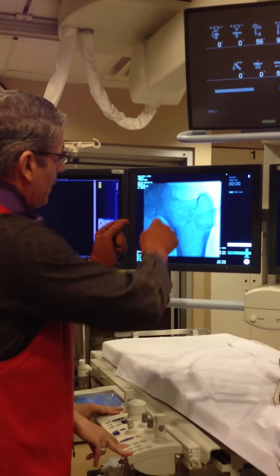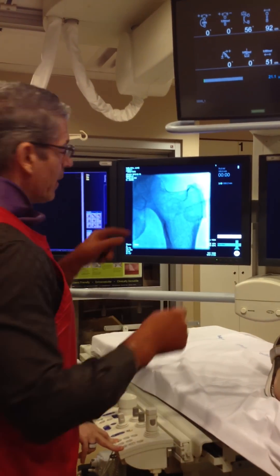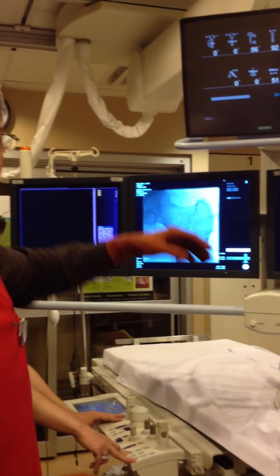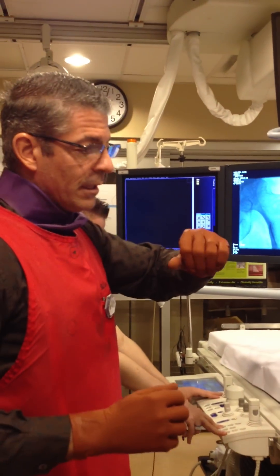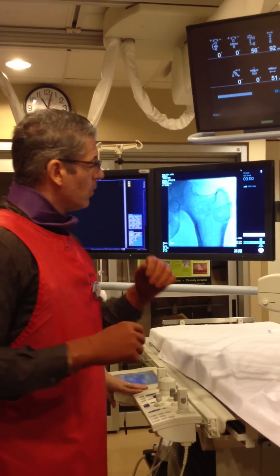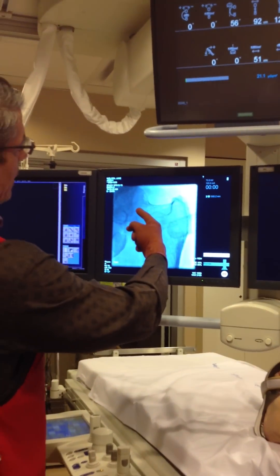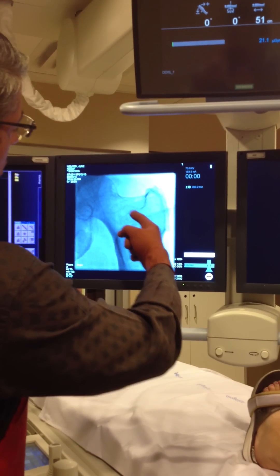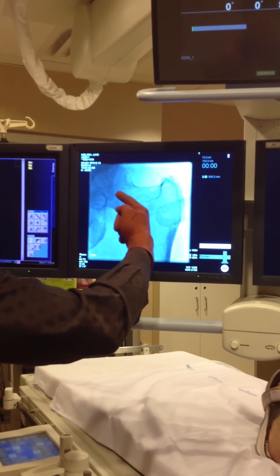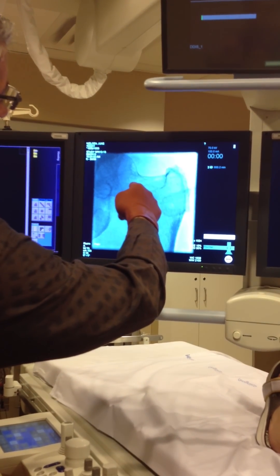The traditional method is to line the needle up and just go straight down over the femoral neck, but that requires you to usually feel for the pulse and maybe try to move with your fingers the femoral pulse — you usually have to move it over, away from the needle. I usually start with the intertrochanteric line and take the needle as I'm going down, going medial and superior, parallel to the femoral neck, trying to end up someplace over here.